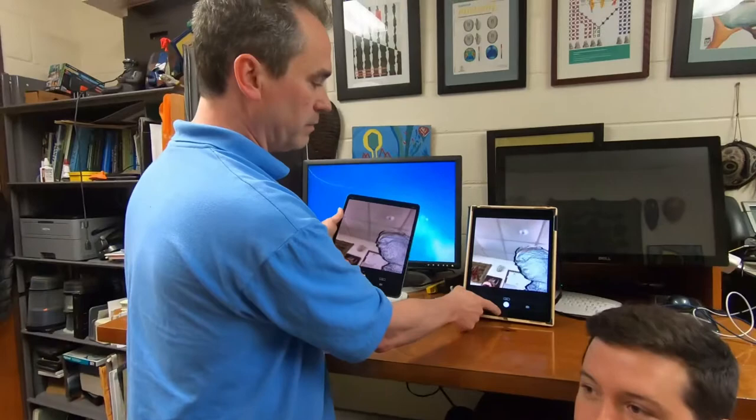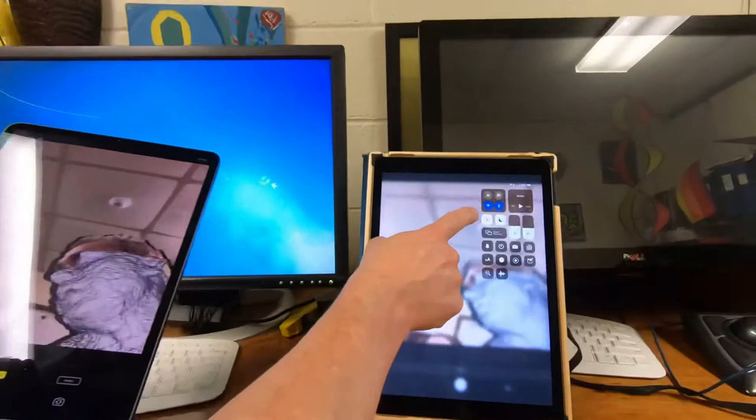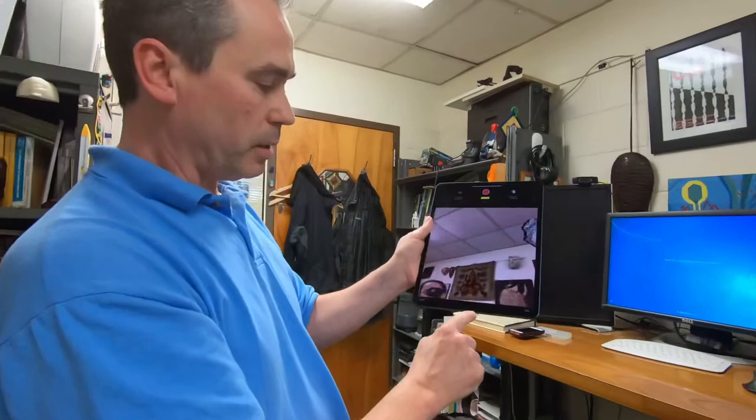You want to make sure you have the screen lock on, because what we're actually going to need to do is turn that iPad upside down. The TrueDepth cameras are here on the bottom of the iPad.